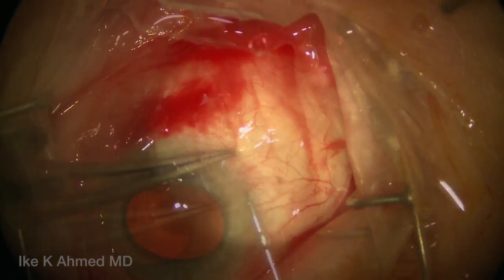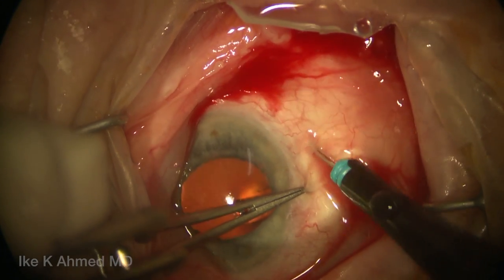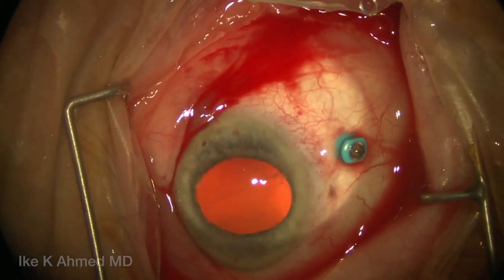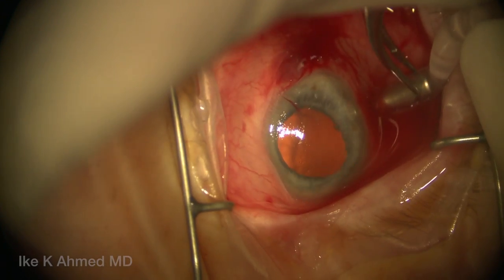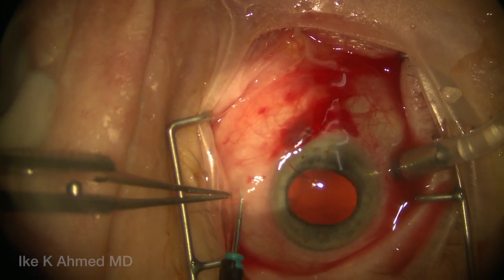3 mm back, we're going to place MVR trocars — 25-gauge trocars — in the supra-nasal quadrant and infra-nasal quadrant. These will be used for our irrigation. We're placing a posterior infusion line, and we check to make sure the infusion is in the vitreous cavity when it's placed.